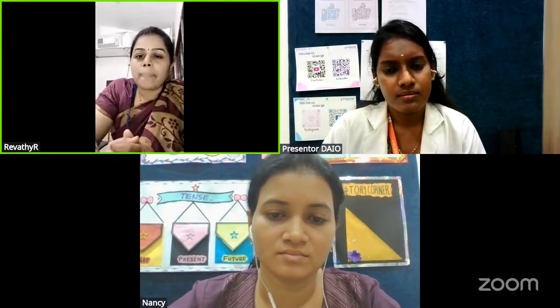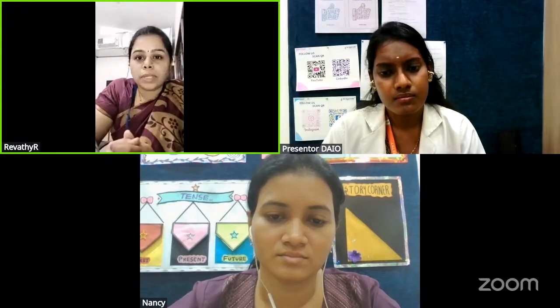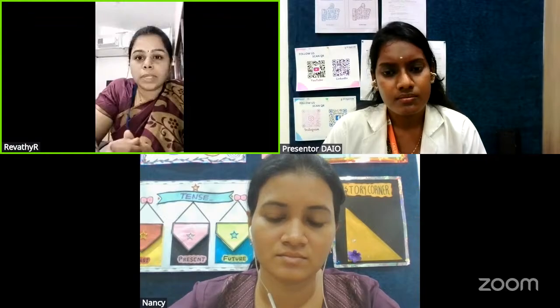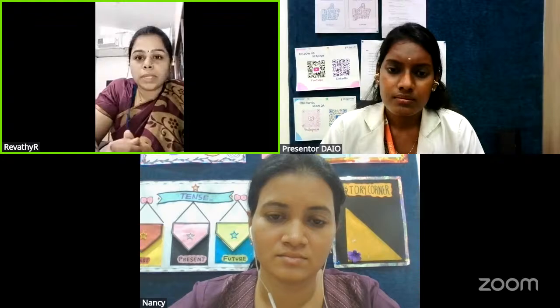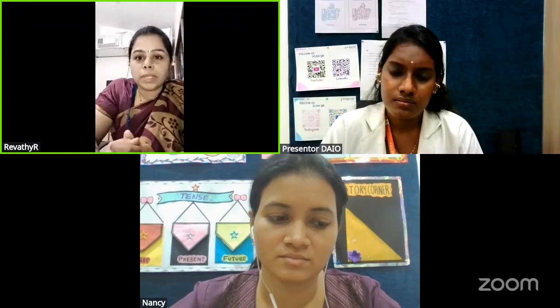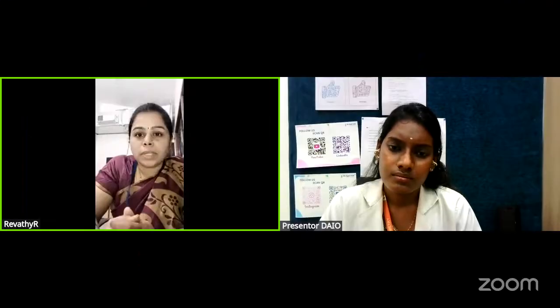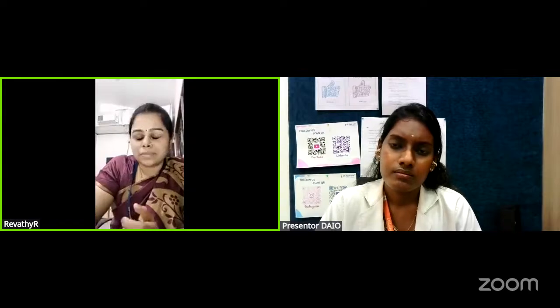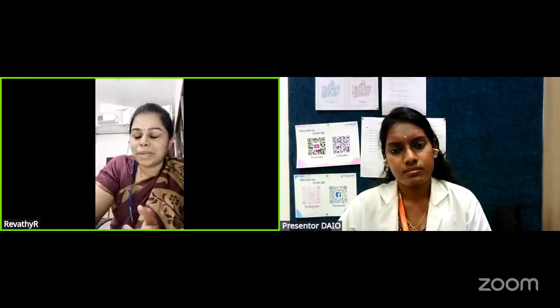You get to see the reflex, right? Which you are not seeing in the autorefractometer. If there is a small corneal opacity or small lens opacity, you get to see it. If it is in the visual axis, you get to see it only in retinoscopy. And the quality of the reflex, how is it? Is it scissoring? Everything can be told with a single look, if you focus the retinoscope on the patient's eye.